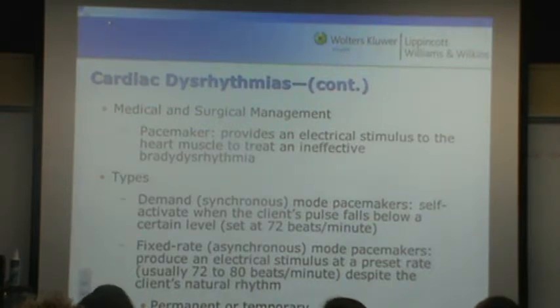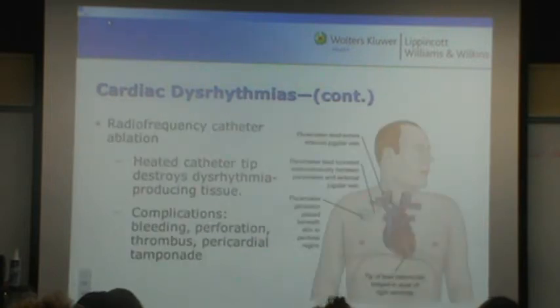For a certain period of time after their surgery, they still have that external pacemaker, and then after X number of hours, they remove it. So they can be permanent or they can be temporary. Like I said, generally the only time you're going to see a temporary pacemaker would be in a surgical intensive care unit, something like that, or just post-surgery.